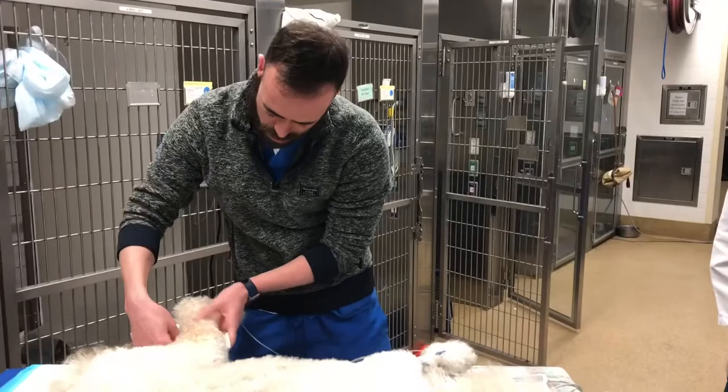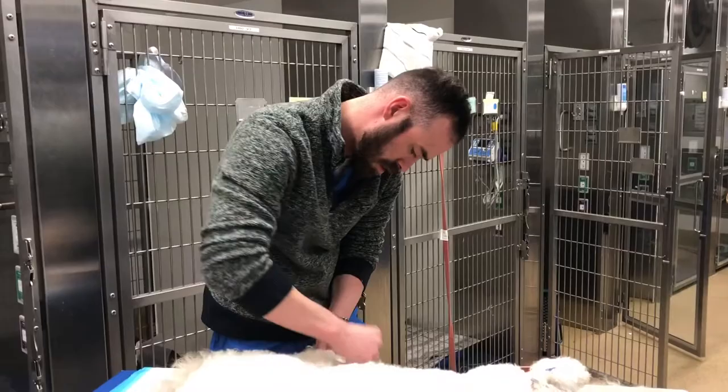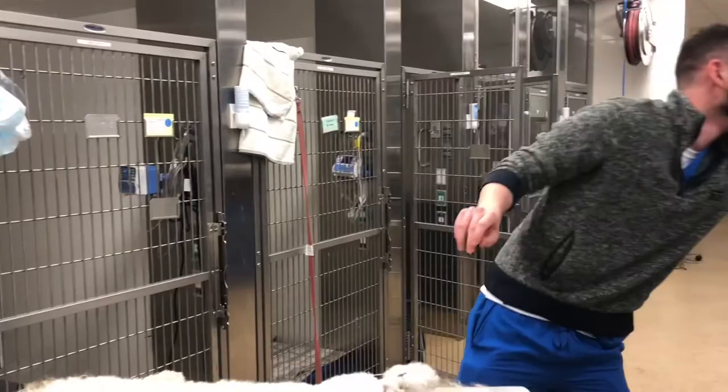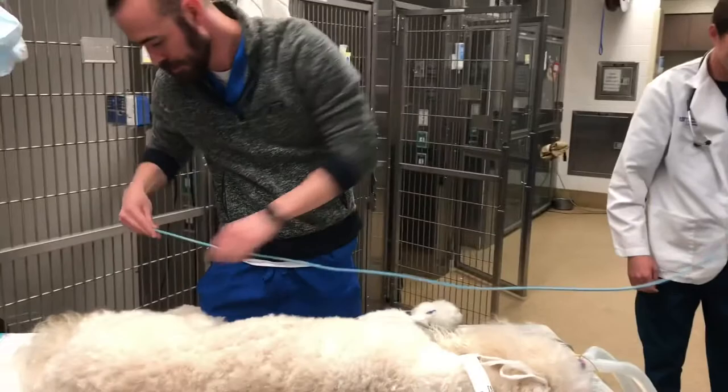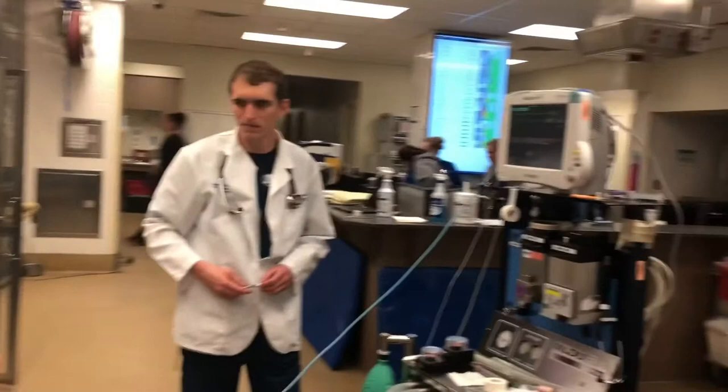The last is going to be an oscillometric blood pressure cuff. That's going to get a snug fit around a pelvic or a thoracic limb, and that is going to give you a mean blood pressure, diastolic, and systolic. Ideally you want your mean blood pressure to stay around 80, and anything below that is something you're going to want to do something about.